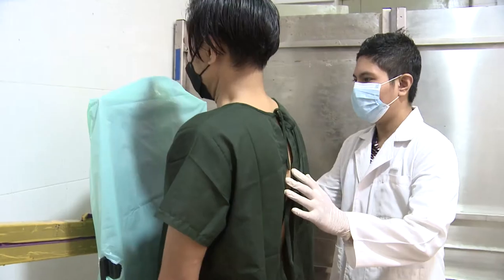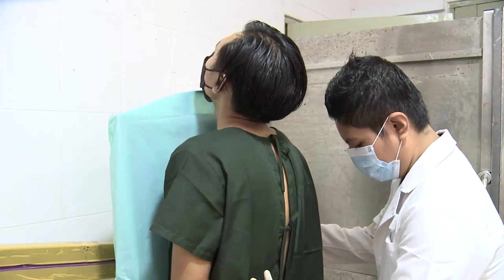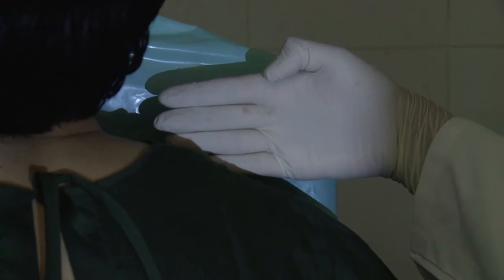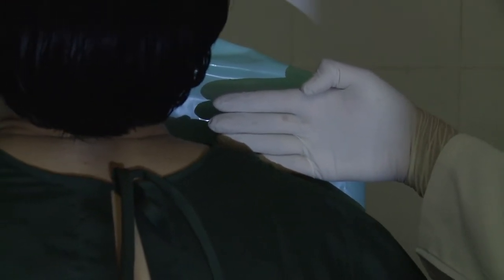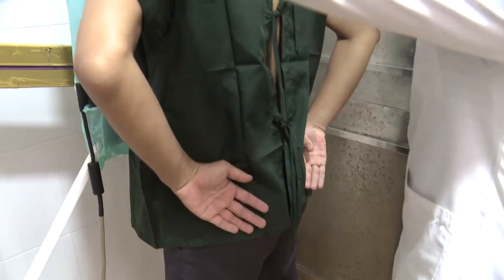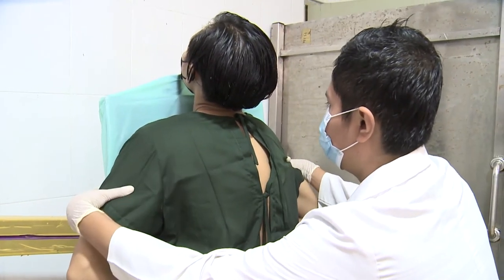Steps for chest x-ray patient positioning. 1. To take a chest x-ray in the posterior-anterior (PA) position, have the patient stand upright with their chest against the image receptor (IR) plate. Ask the patient to spread their feet slightly to evenly distribute their weight. Check that the upper border of the IR is approximately two inches above the patient's shoulder. Have the patient raise their chin to prevent superimposing lung apices. Position the central ray (CR) at the inferior border of the scapula, that is, T7 level. Check that the alignment of the CR and IR are centered. Place both of the patient's hands on their hips and have their elbows bend forward toward the IR as much as possible. Place the right or left marker on the right or left upper corner of the IR. Collimate the four sides of the lung fields. Ask the patient to not move, then go to the control panel to take the x-ray.